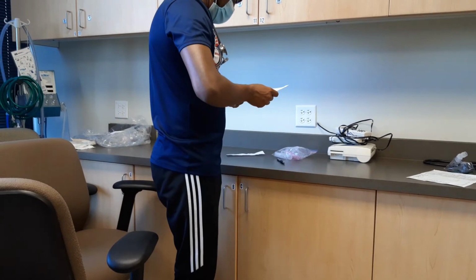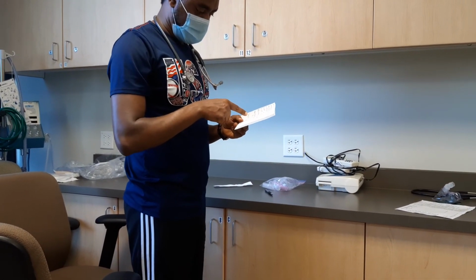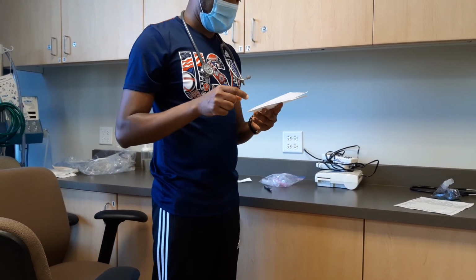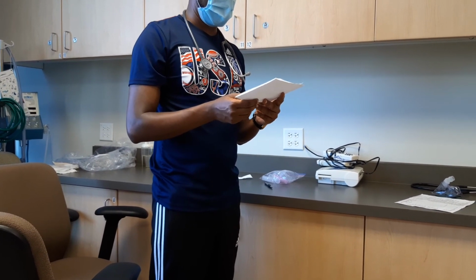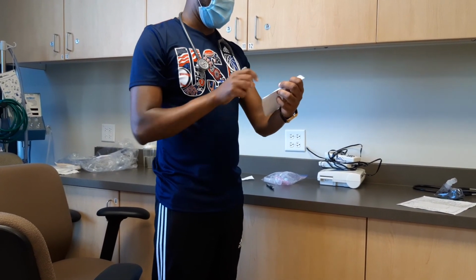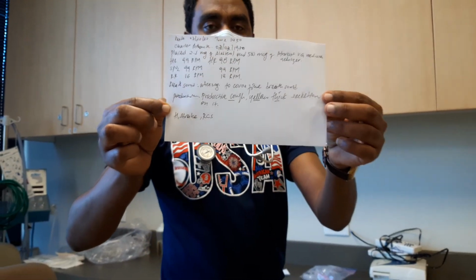Alright, I'm here in the station. I recorded a productive cough with yellow, thick secretions, and I recorded heart rate, respiratory rate and pulse oximetry before and after. I recorded the date and time and everything, and the medication given. And here is my documentation for today.